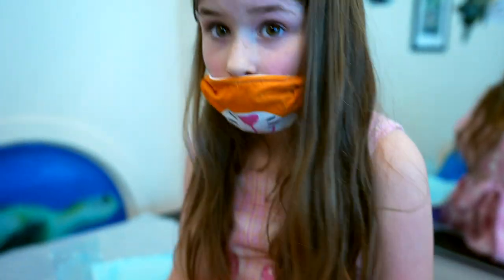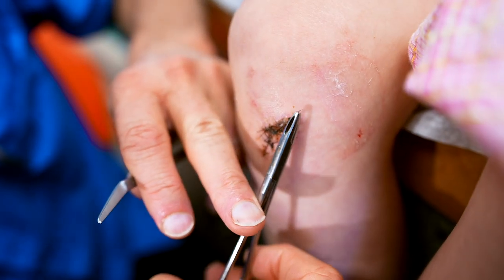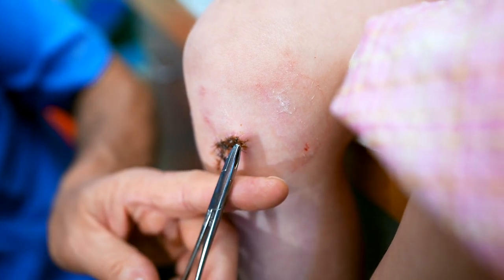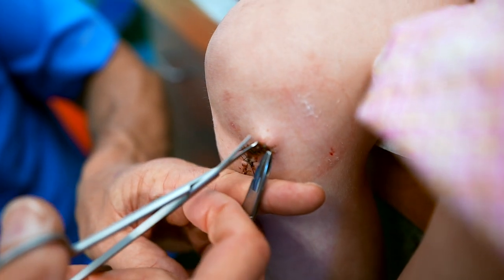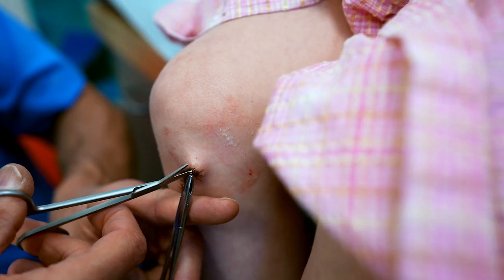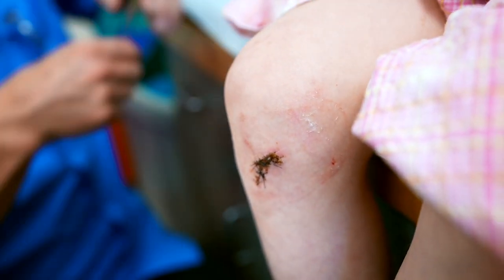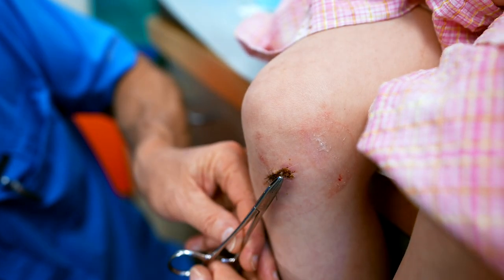You know what always helps? See yourself on camera. Everyone always smiles when they see themselves. You look really good on camera. Another tight one. And you're doing excellent with the light. This is teamwork. Nice job. We got three — three and counting. Three down, five to go.